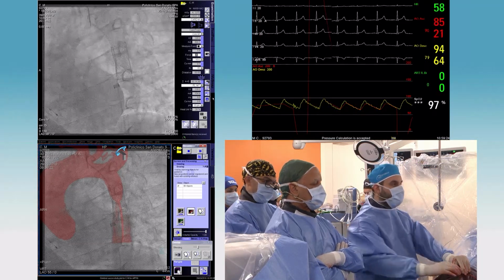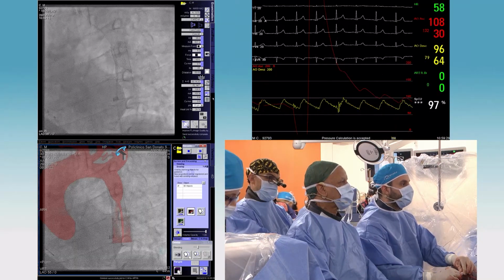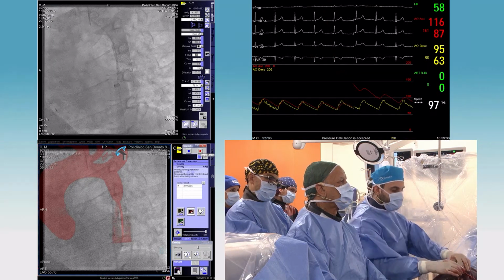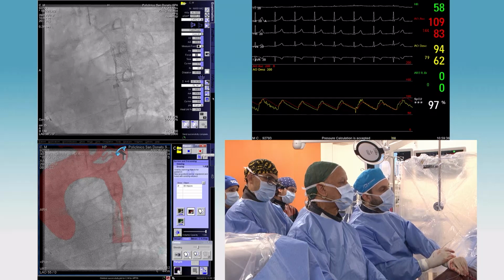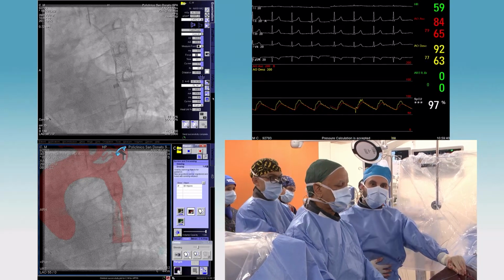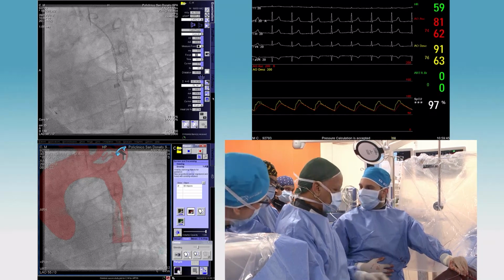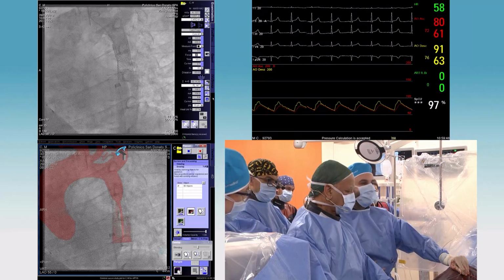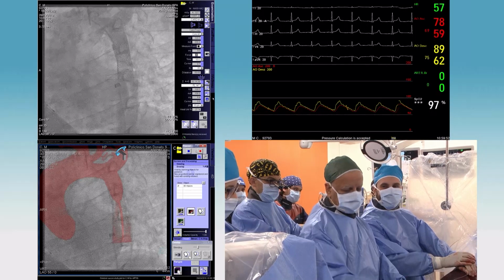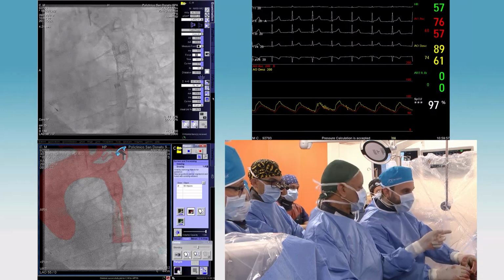Okay, all right, we didn't do 3D, but I'm happy with that. What do you think, Carlos and Amy? Looks great. I think it's certainly reasonable to just do a 3D afterwards too and not do the 2D. Hey guys, let's do a real angiogram, not a PC-gram. Come on. All right, 3D. He wants a proper angiogram, Luca. Luca's sending the mafia people around to you, Carlos. Okay, shall we do a 3D RA?